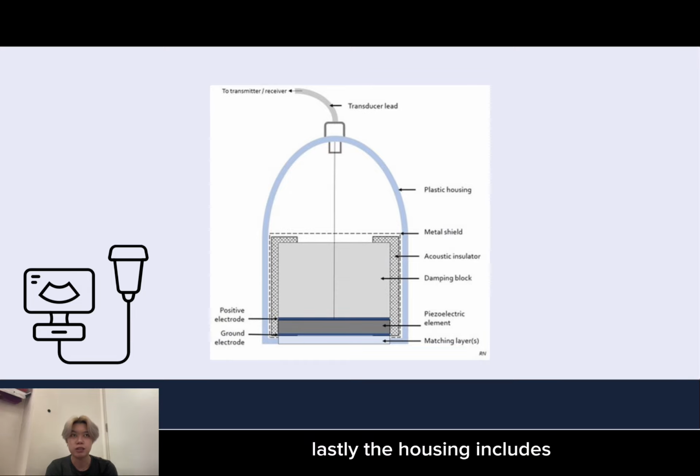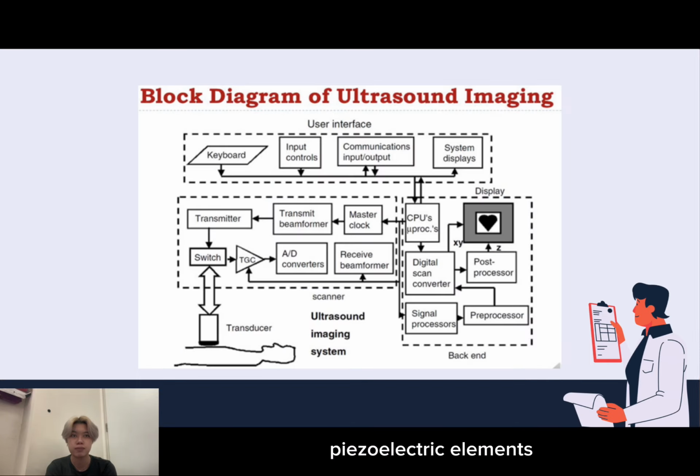Lastly, the housing includes a plastic case, metal shield, and acoustic insulator, which acts as an electrical insulator and helps protect the piezoelectric elements. This image shows a block diagram of an ultrasound.